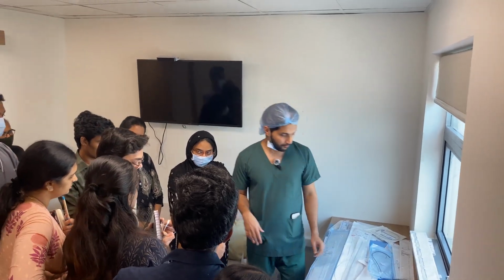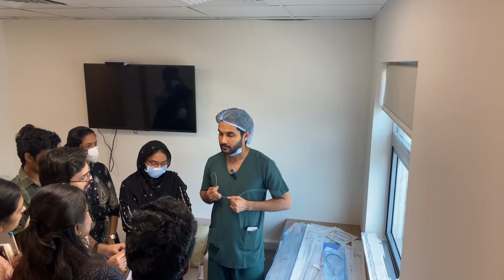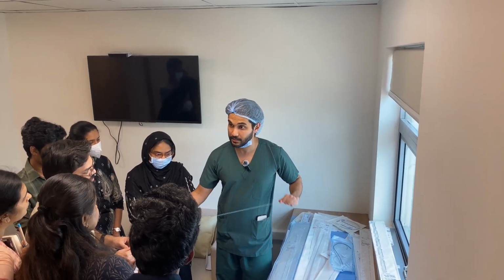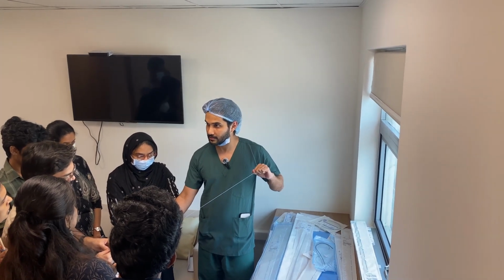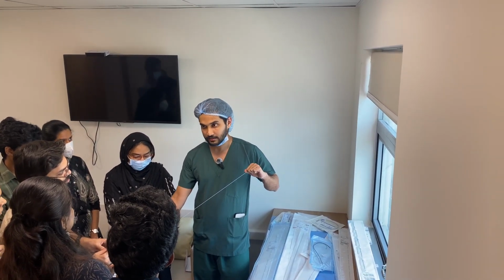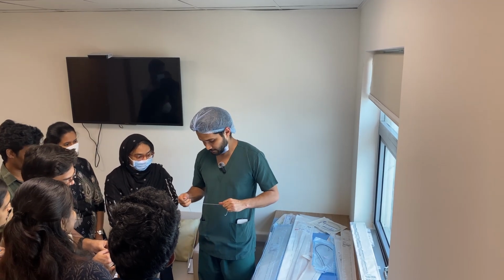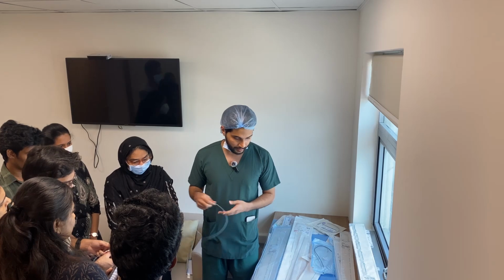പിന്നെ കത്തീറ്ററിന്റെ ഒരു സംഭവം, കത്തീറ്റർ നമുക്ക് ഒരിക്കലും പൊട്ടിക്കാനാവില്ല, വലിച്ചാലും. കാരണം ഇതിന്റെ അകത്ത് സ്റ്റെയിൻലെസ് സ്റ്റീൽ കൊണ്ട് ബ്രൈഡ് ചെയ്തിട്ടുണ്ട്. അതാണ് മെയിൻ സാധനം. ഇല്ലെങ്കിൽ നമ്മൾ അവിടെ എത്തിയിട്ട് വലിക്കുന്ന സമയത്ത് പൊട്ടിക്കഴിഞ്ഞാൽ പിന്നെ വേറെ സർജറി ചെയ്യേണ്ടി വരും. പൊട്ടിക്കാൻ പറ്റില്ല. അതാണ് അതിന്റെ വേറൊരു സംഭവം. കത്തീറ്ററിന്റെ ടിപ്പ് അനുസരിച്ചാണ് നെയിം വരിക.